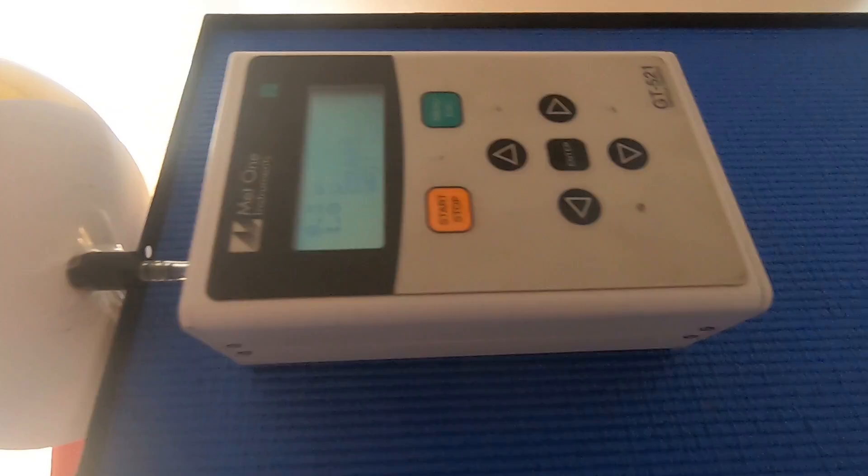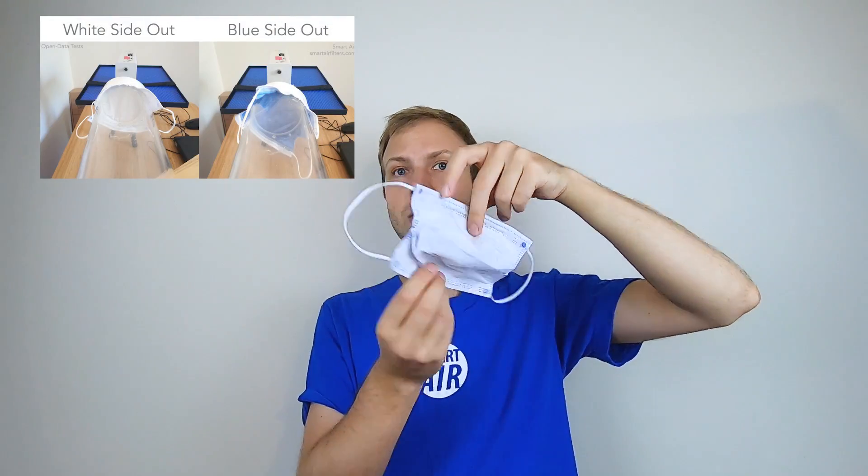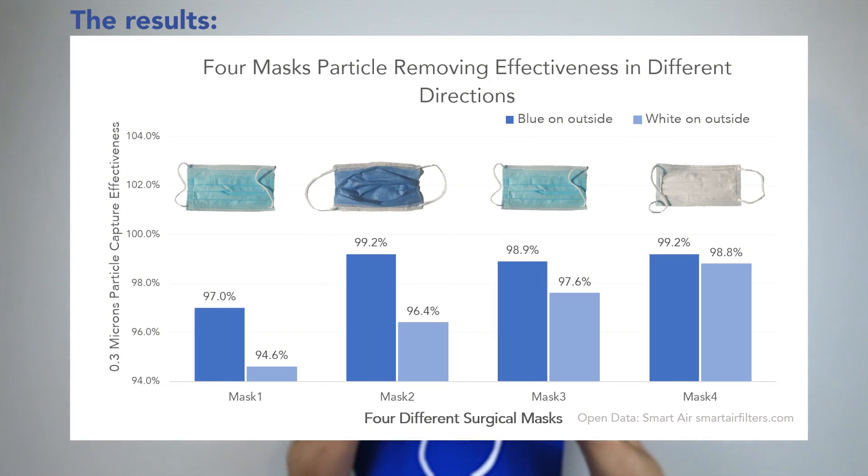What we did at Smarter to test this is we tested four different surgical masks using our wind tunnel test equipment. We put these masks on the end of our test equipment and we measured the number of particles that could penetrate through the mask in both directions. And what we found was that, yes, there is a difference depending on the way that you wear your mask.